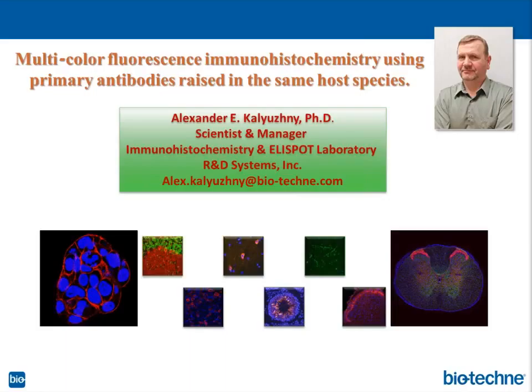This is a very good question, and actually I've been thinking about giving a separate webinar on how to get rid of endogenous autofluorescence, because this is a very serious issue. Yes, you're correct. When you have endogenous autofluorescence due to fixation or overfixation or due to the presence of substances in the tissue, it's incredibly difficult to do immunofluorescence, because this endogenous fluorescence will obscure specific signals.